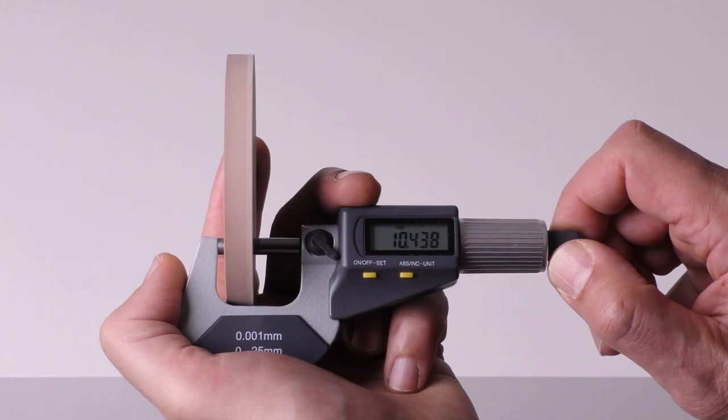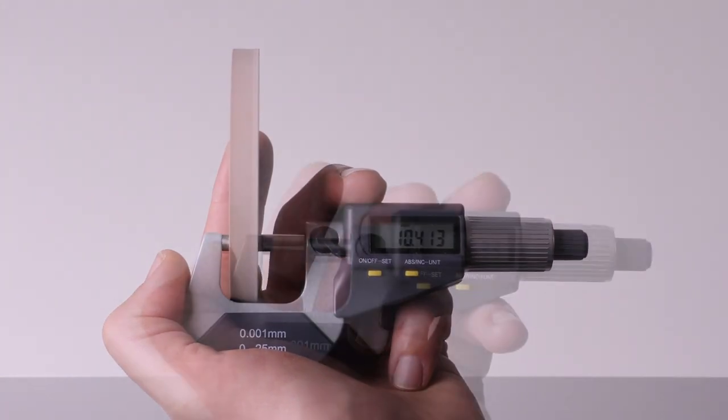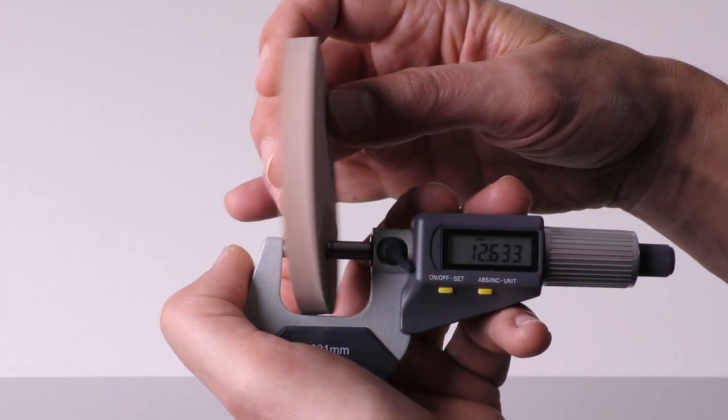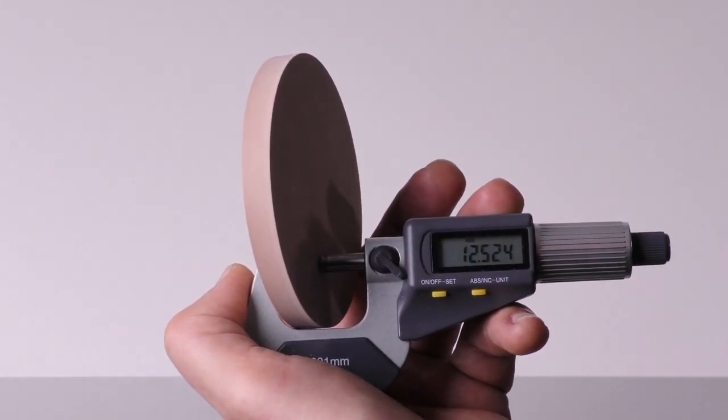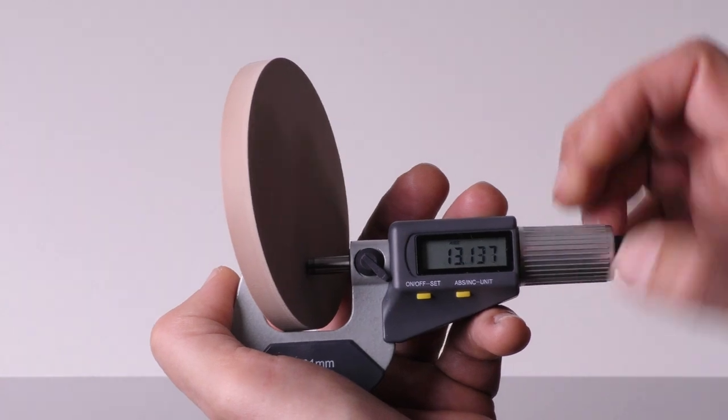Another mistake when measuring is to place the micrometer at an angle on the specimen. This will also significantly falsify the measuring result.